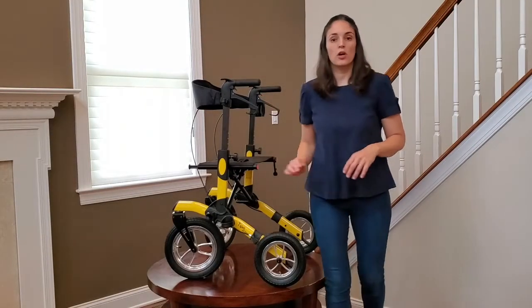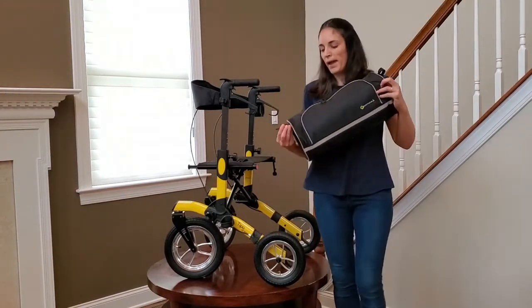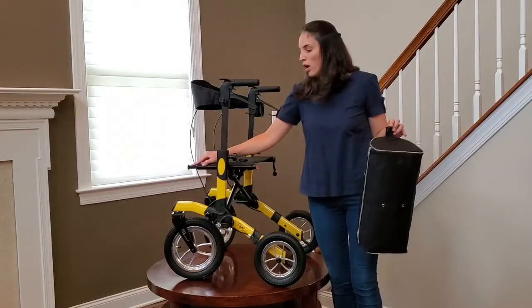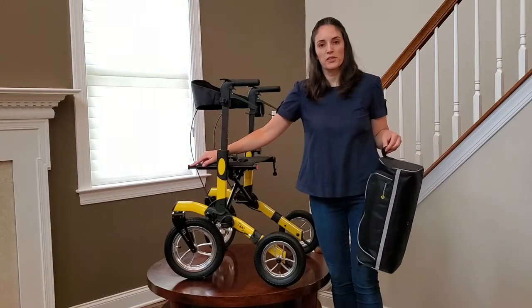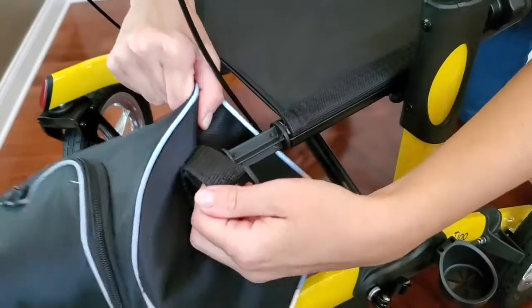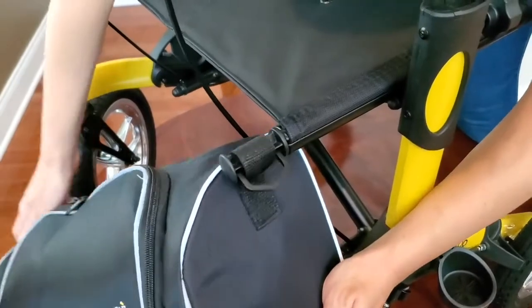Now we're going to install the shopping bag. The shopping bag has loops on each side. Those loops are going to go on the plastic support on the other side of the seat. Slide them in on both sides.